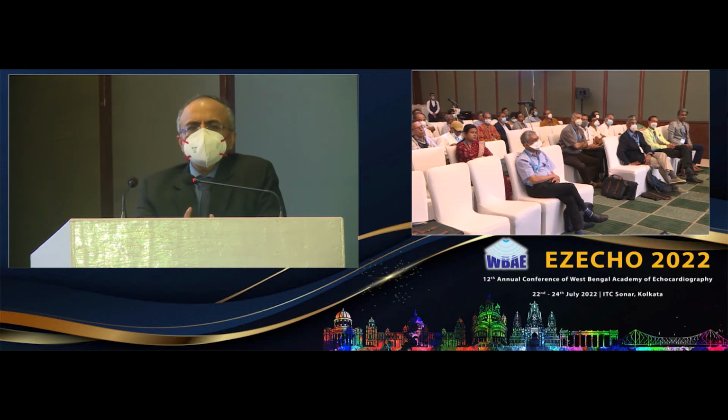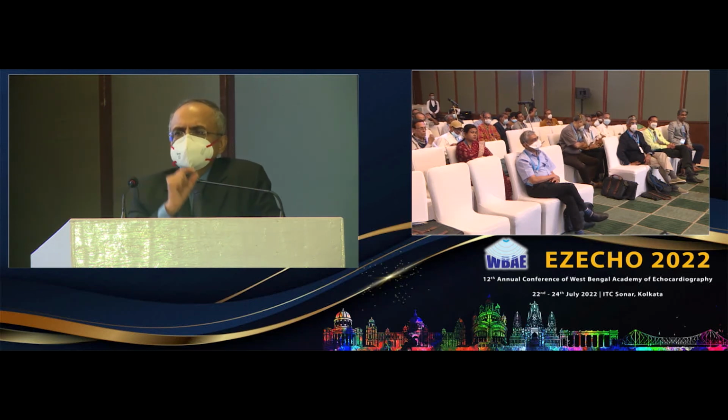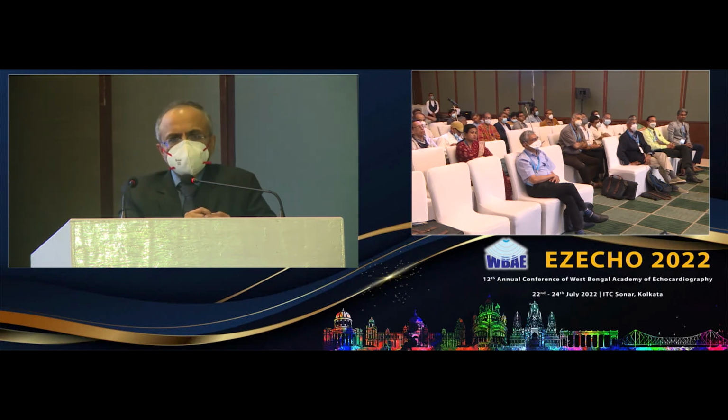And then here the MRI will help me in getting a precise thickness, because I will get a precise slice perpendicular to the long axis. In the echo, I may not be really many times confident, because with slight tilting, I may get a slightly oblong view and a little higher thickness. So that is one thing that MRI will help me with, just looking at the thickness.